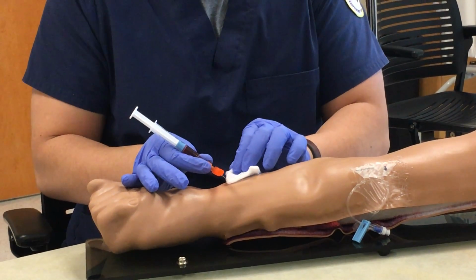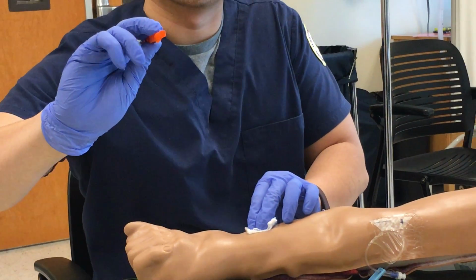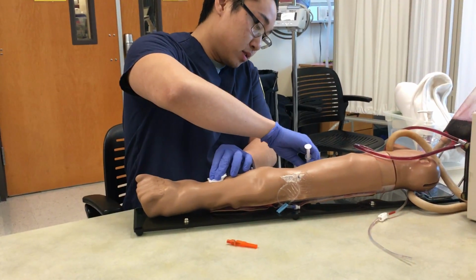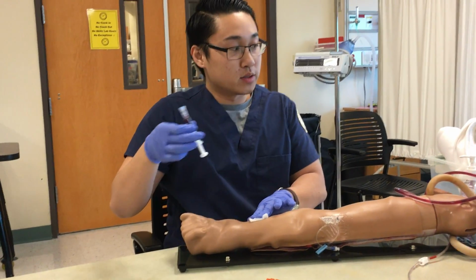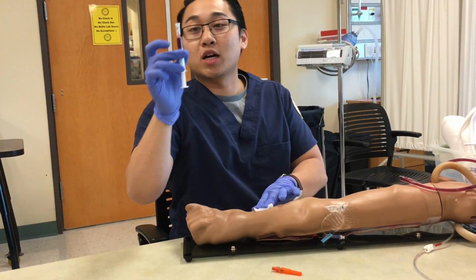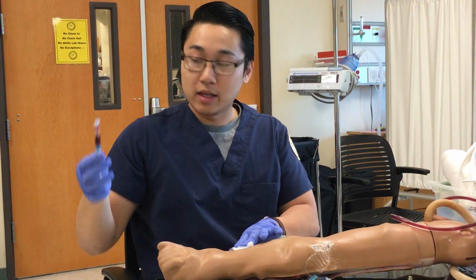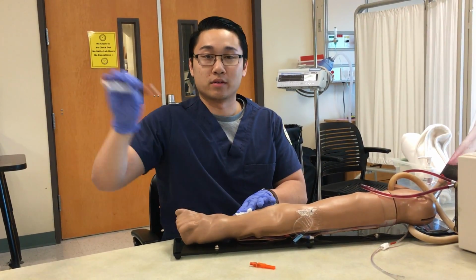Alright, now that it's full, I'm going to take this out and put pressure while I close the protection cap away from my body. I'm going to take the needle off and put the air bubble cap on. As I put pressure on his puncture, I'm going to take the bubbles and put them to the top by tapping it, and I can press the blood into the cap and take out any excess bubbles. Now I'm going to shake the ABG to mix the heparin and the blood together.